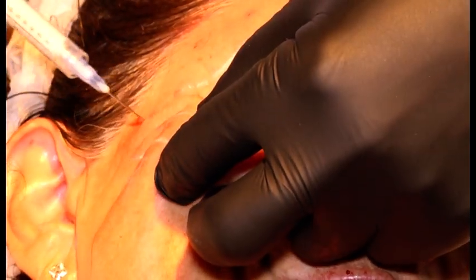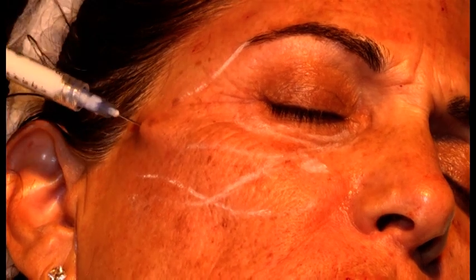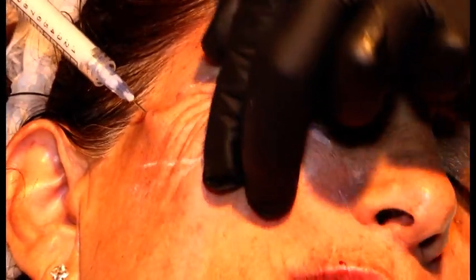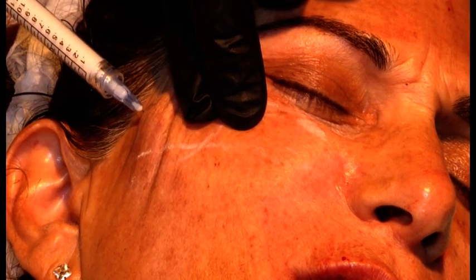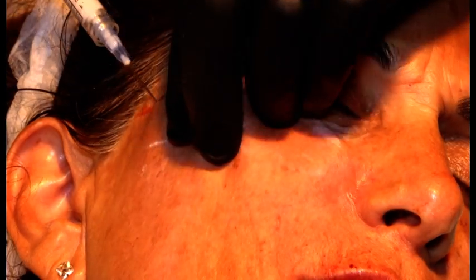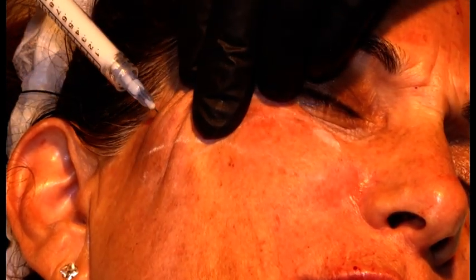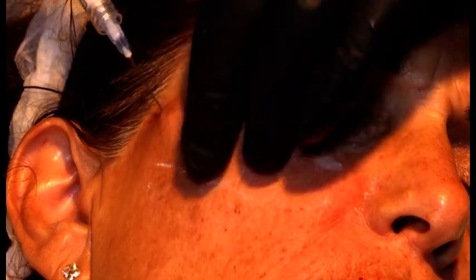I advance again over periosteum, and I feel resistance. So I feel that resistance, so I lift up the ligament and go click through. I give a little bolus and a retrograde. Again, I continue over periosteum, a little resistance, bolus, retrograde.